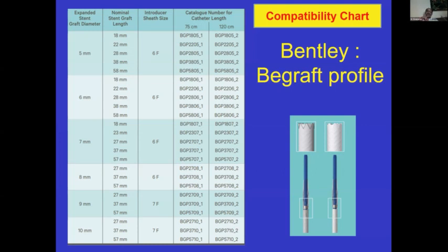What is your view, Dr. Shak and Worakan, on use of this particular product in smaller patients? Worakan, do you want to answer that? Because for me, I try to use B graft if I have to, any diameter larger than 10. As Shiva mentioned, it may be difficult to post-dilate up to 15 or 20. So I'm quite doubtful if I'm going to use B graft below 10 millimeter.